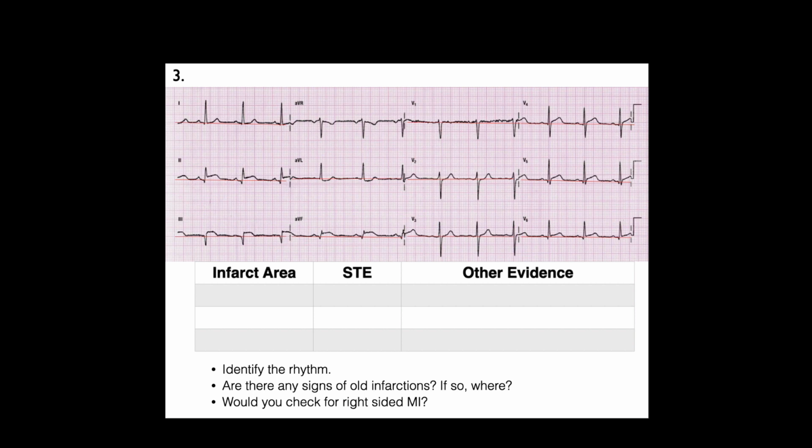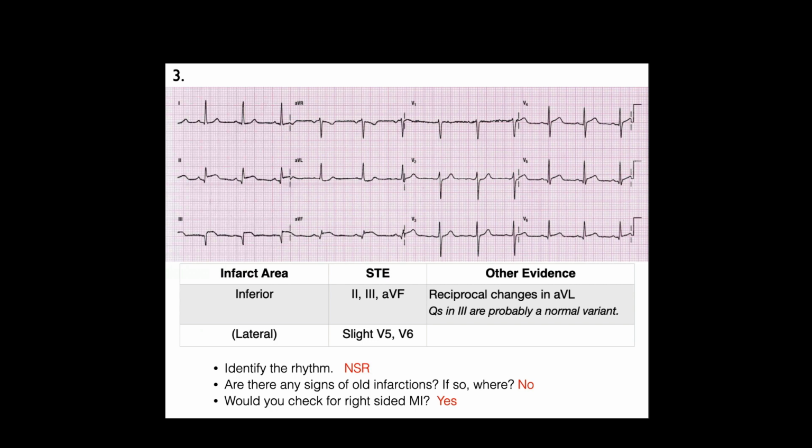I have a question. The Q on III, I said that was pathological. That was one of the mistakes, one of the things I changed. So let me tell you what the issue is. I've always struggled with whether to teach this or not, and this year I'm teaching it. The 12 leads have all these funny little details, all these exceptions.